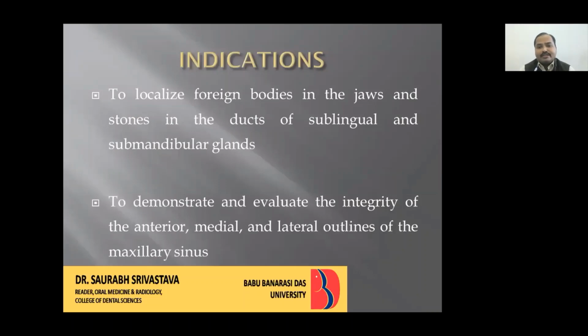It is also used to evaluate the integrity of the anterior, medial and lateral outlines of the maxillary sinus. If we take the maxillary occlusal view, we can see the sinus outlines and check their integrity, meaning there is no break in the outline of the sinus.